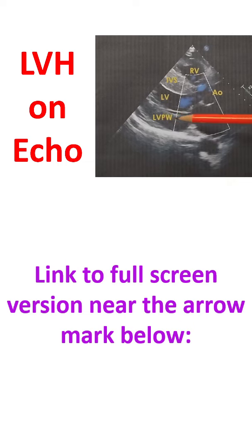This is the left ventricular posterior wall. Again, you can see that the inner portion is sonolucent because more of the reflections occur at the edges. Echo is detection of the reflected ultrasound beam. This is left atrium, a bit dilated, aorta. So this is concentric left ventricular hypertrophy seen from the parasternal long axis view.